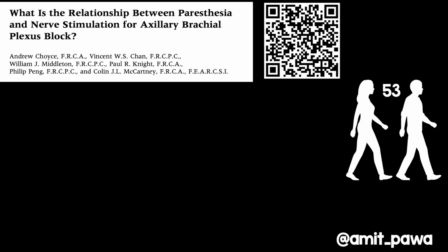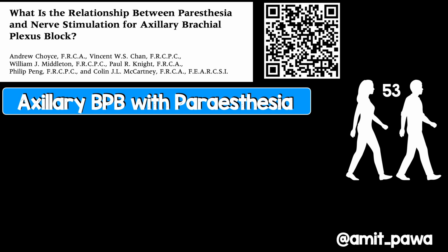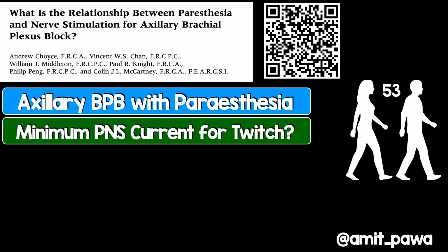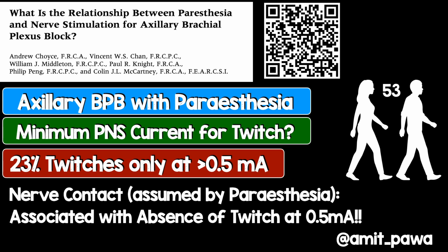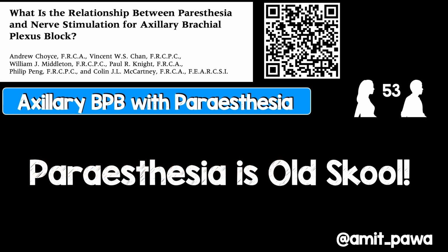I'm not going to do the 3 little pigs, but now I'm going to talk about a study on 53 humans. So in this paper, they performed an axillary brachial plexus block using paresthesia as an endpoint. And once they'd elicited paresthesia, the idea was to determine what the minimum threshold current was in order to get a twitch. Now, when these needles had elicited paresthesia, in only 23% of cases did they get a twitch at greater than 0.5 milliamps. So they got paresthesia, the needle was touching the nerve, but in only 23% of cases did they get a twitch at greater than 0.5 milliamps. So what we've determined here is that nerve contact, assumed by paresthesia, was associated with an absence of twitch at 0.5 milliamps.